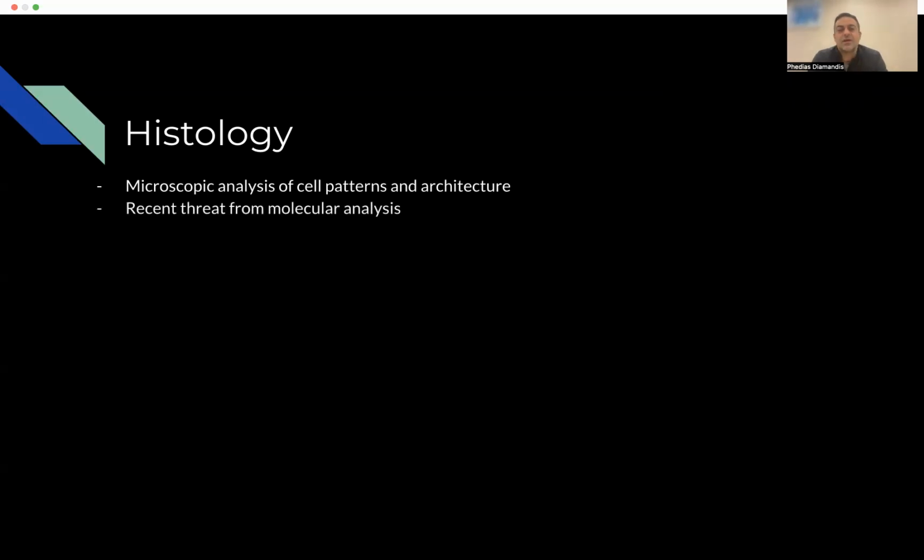As I mentioned, there's some subjectivity, as you can imagine, of what we just did. Some pathologists may interpret what I saw differently. And of course, the same pathologist can also interpret the same slide differently, depending on their specific level of concentration, workload, and other cases that they've seen in their recent memory. So this is one of the critiques of histomorphology, where it should be improved by other techniques.